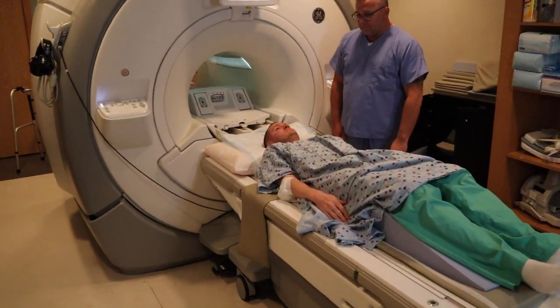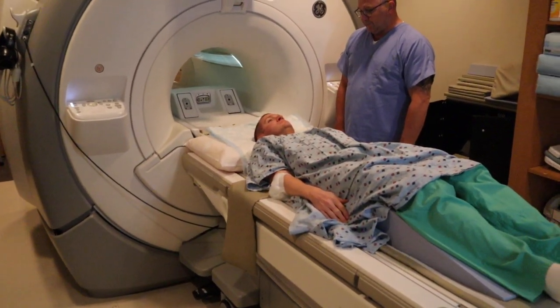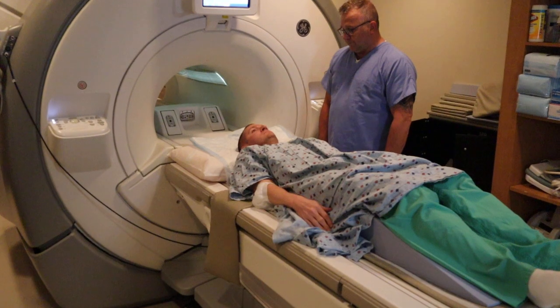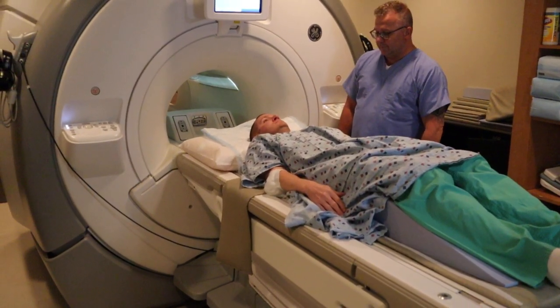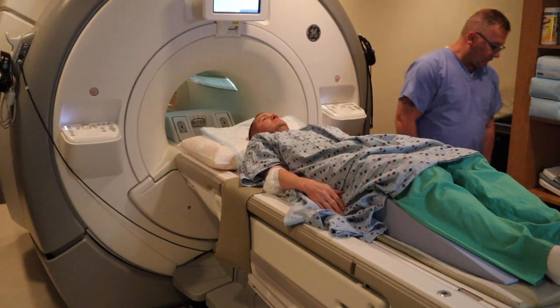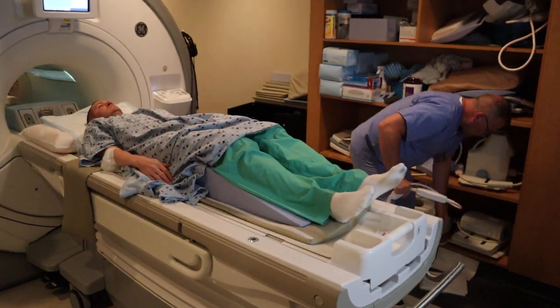You want to raise the table up. Once the table is up, you want to attach the dedicated shoulder coil.